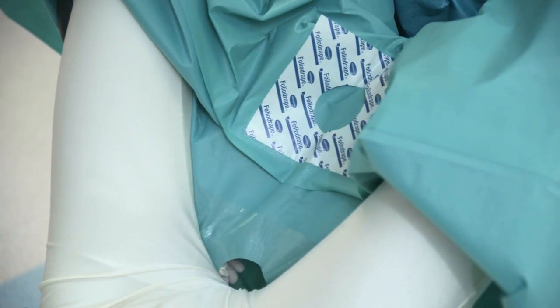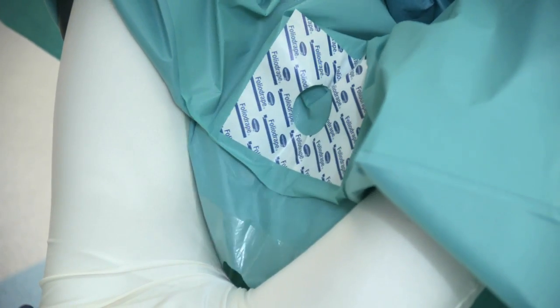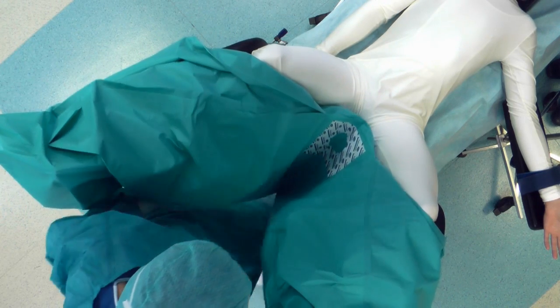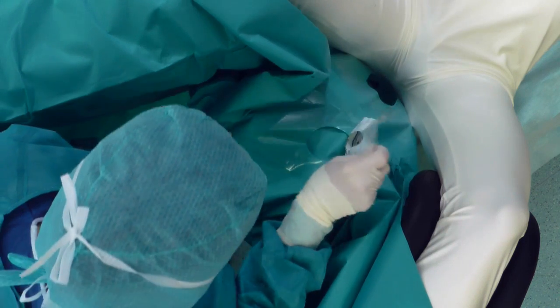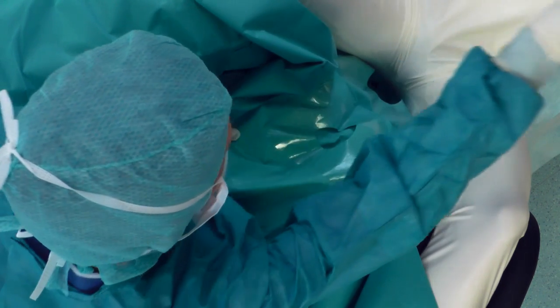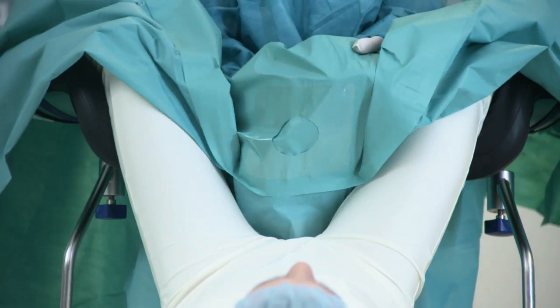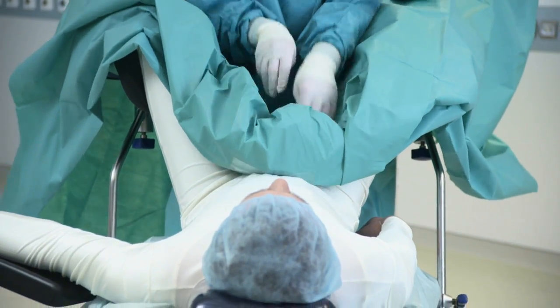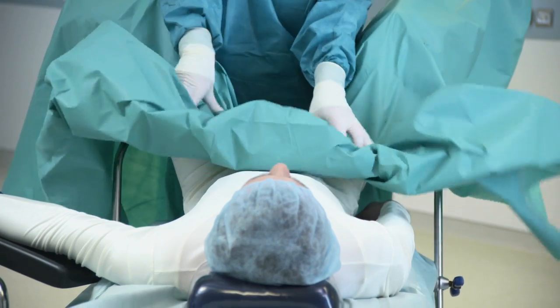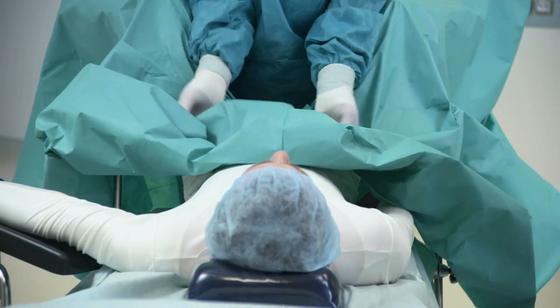Adhesive areas around the apertures ensure secure fixation of the drape throughout surgery. The adhesive is resin-free and thereby particularly gentle on the skin. The drape is folded in such a way that it can be spread out over the patient with just a few hand movements.